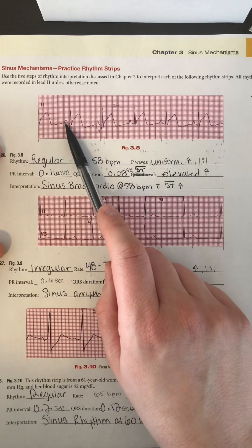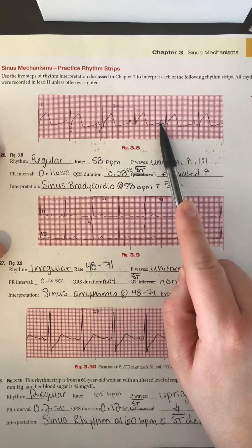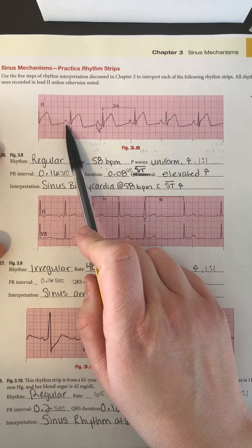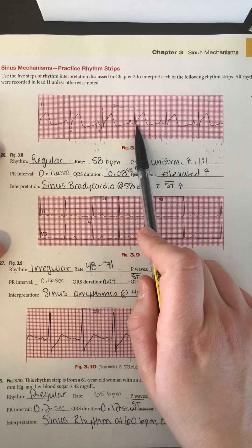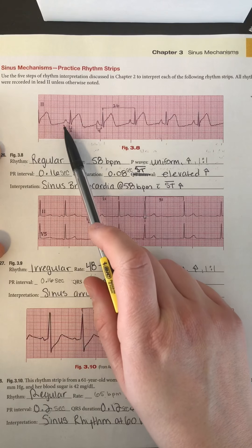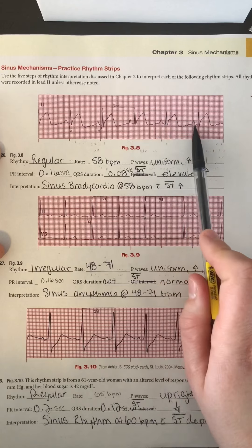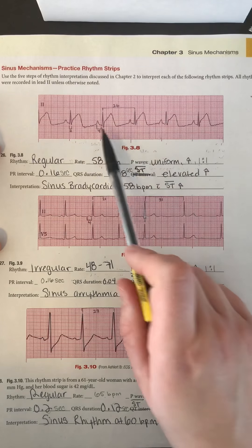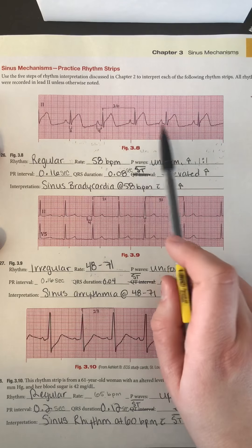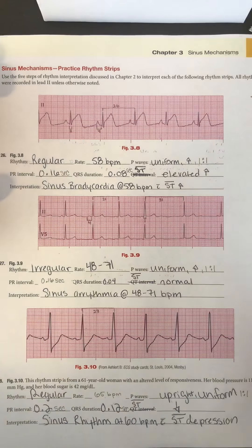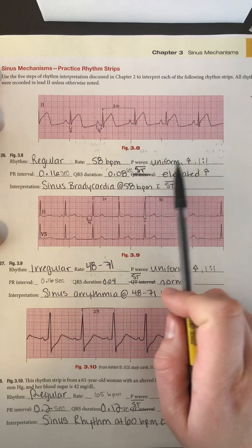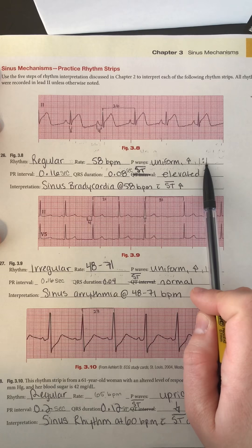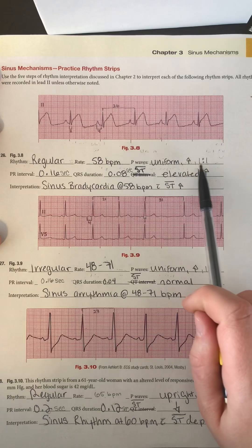Next I want to look at the P waves. These are the small waves that appear before the QRS complex; they represent depolarization of the atria. I want to make sure I have one P wave for every QRS complex — and I do. They're all upright, meaning a positive deflection, and they all look pretty much the same. There are maybe some slight differences, but not enough to make it a wandering pacemaker. So they're uniform, upright, and one-to-one — meaning one P wave for every QRS complex.